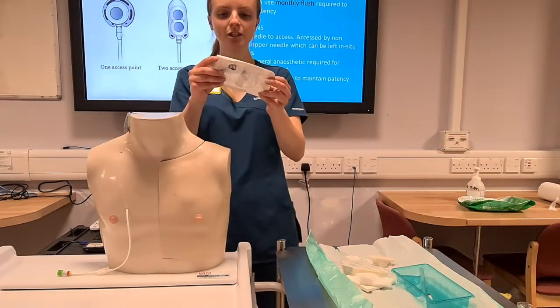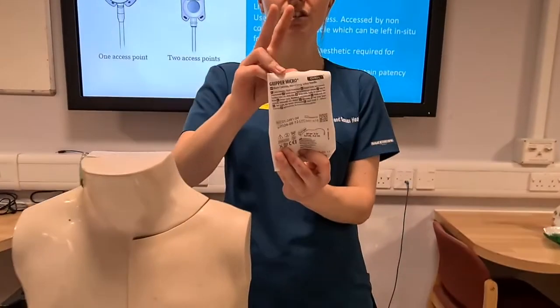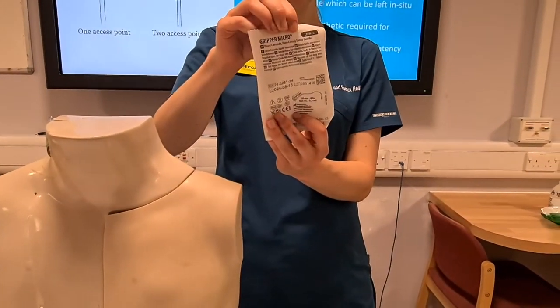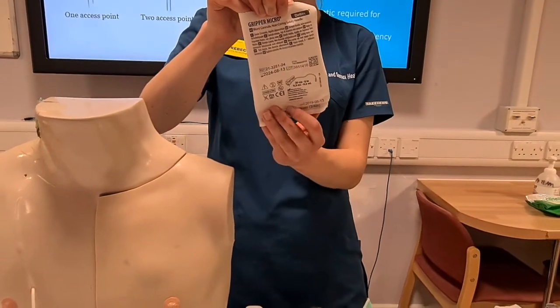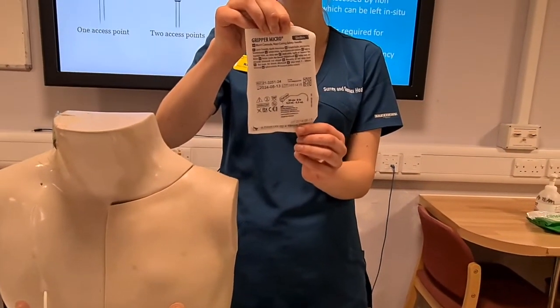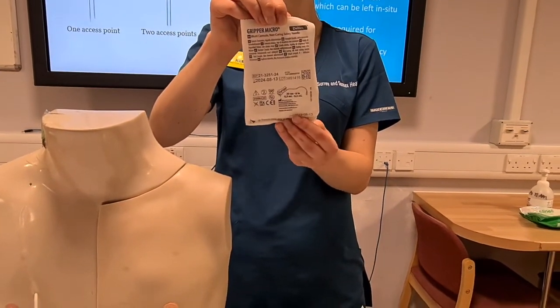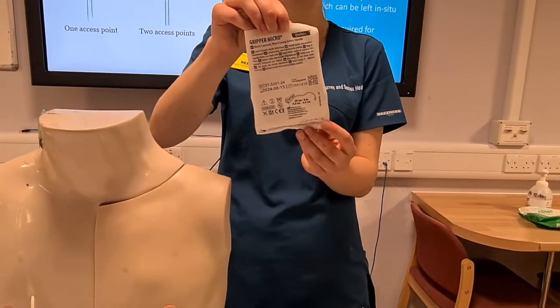Right, most important bit of your access is your microgripper. You have two sizes. You have your 1 inch and your 3/4. Ask your patient what size they normally have. They may know if they do not. Always start off small and then go for the bigger one.